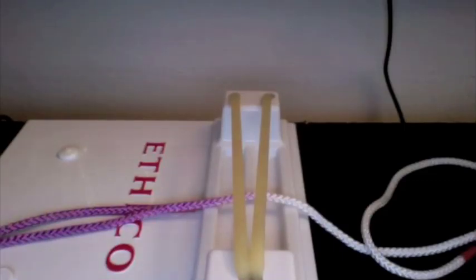This is video number one of three, showing you how to do a two-handed surgical knot. The way you're going to start this is setting up with your Ethicon knot tying board with the purple strand on the left and the white strand on the right.